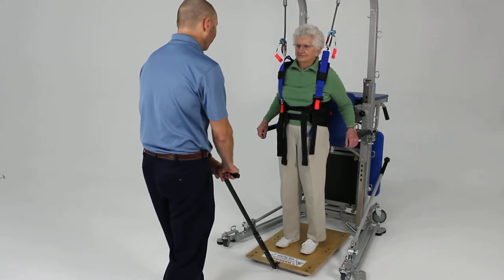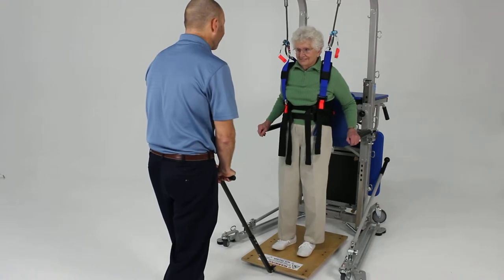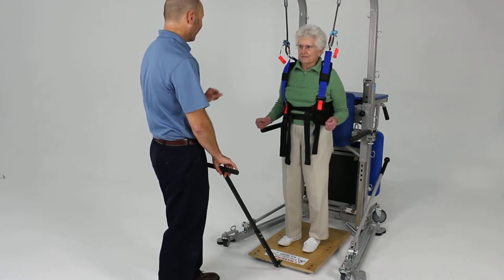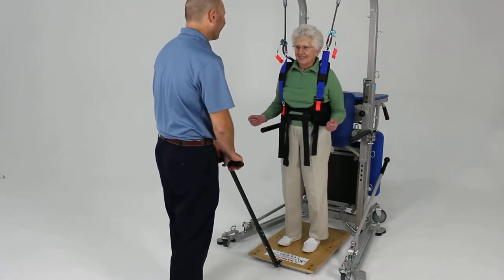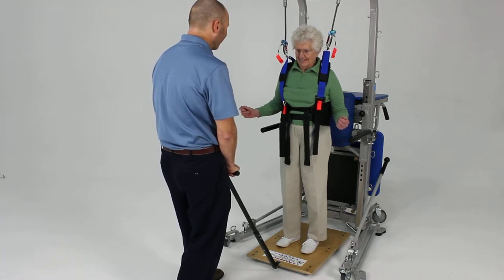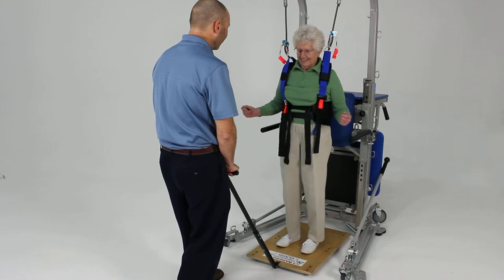We're going to do little pulls and pushes to induce a reaction that you have to maintain your balance. Try to keep your hands off of that. I'll just make these very small to start with — I'm not trying to throw you off balance yet. Good. Nice reaction. Good.